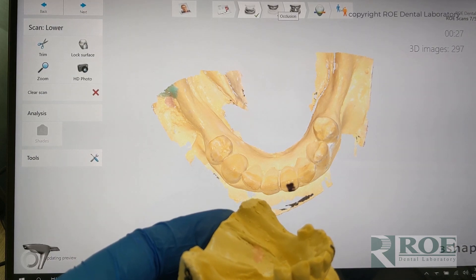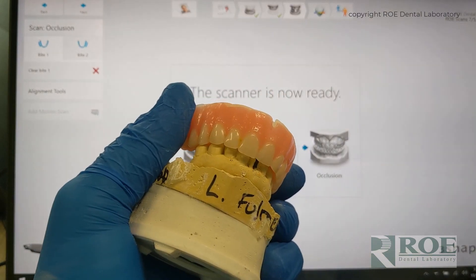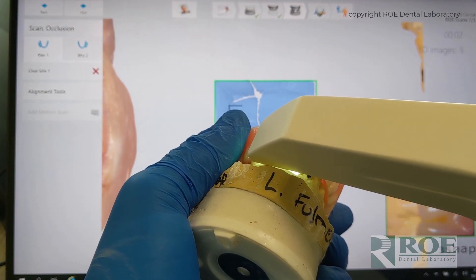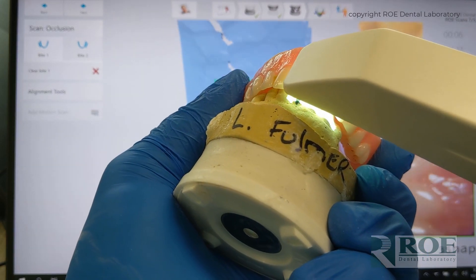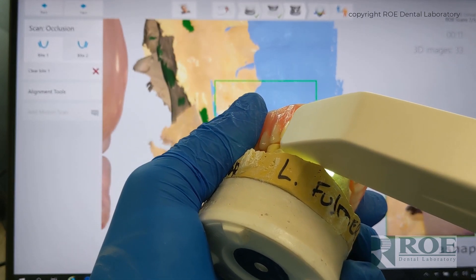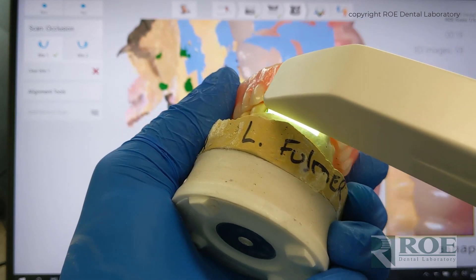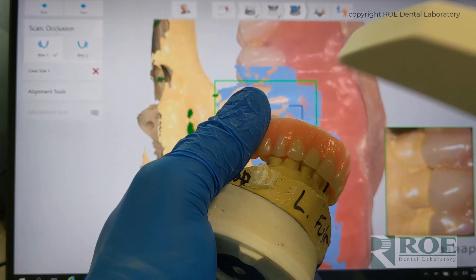Upper and lower are done, so let's do the bite. I'm just going to hold this in position for demonstration purposes. As we always say with bite scans, try to capture a lot of teeth — don't necessarily stop just because it registered. We have the lower. I like to keep capturing and get a nice broad bite, so if it doesn't come over in perfect calibration, at least we have a nice bite registration.